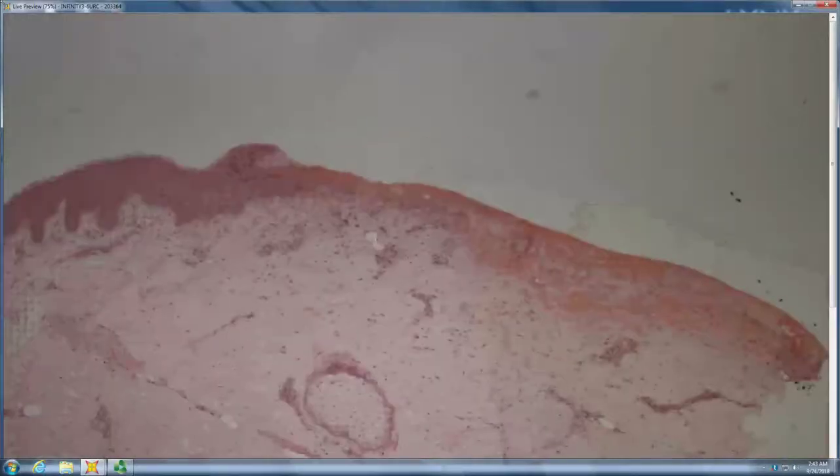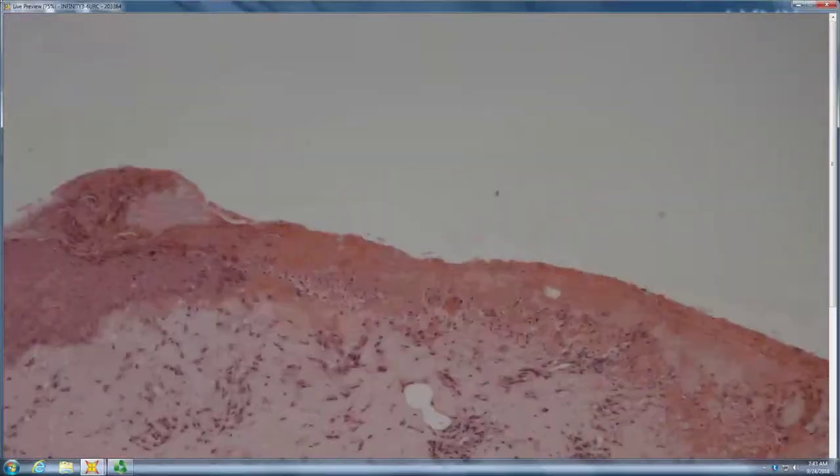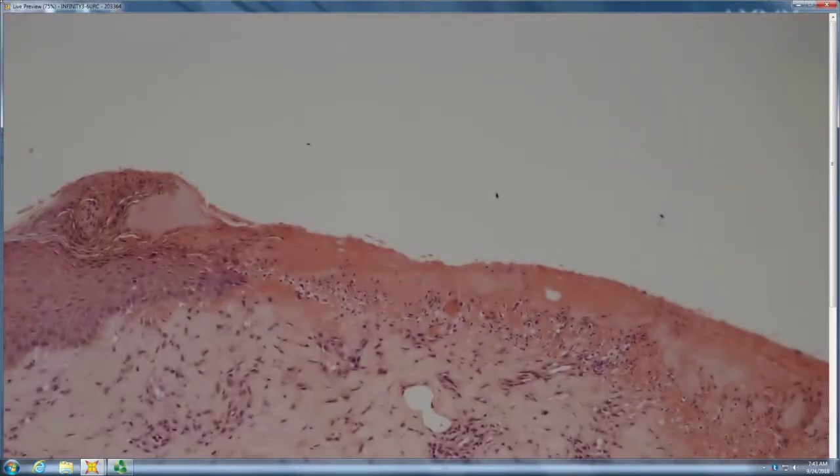And so this one, you kind of just have a late ulcer with lots of fibrin. IF was positive. It started in a radiation port for breast cancer, and it's very, very common for both pemphigus and pemphigoid to start in sites of either solar or therapeutic radiation burn and then generalize.